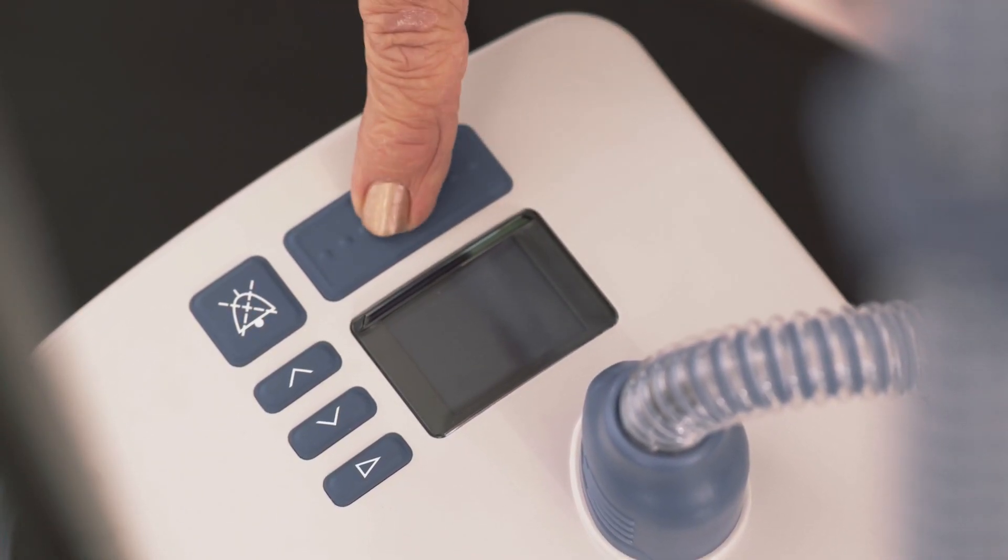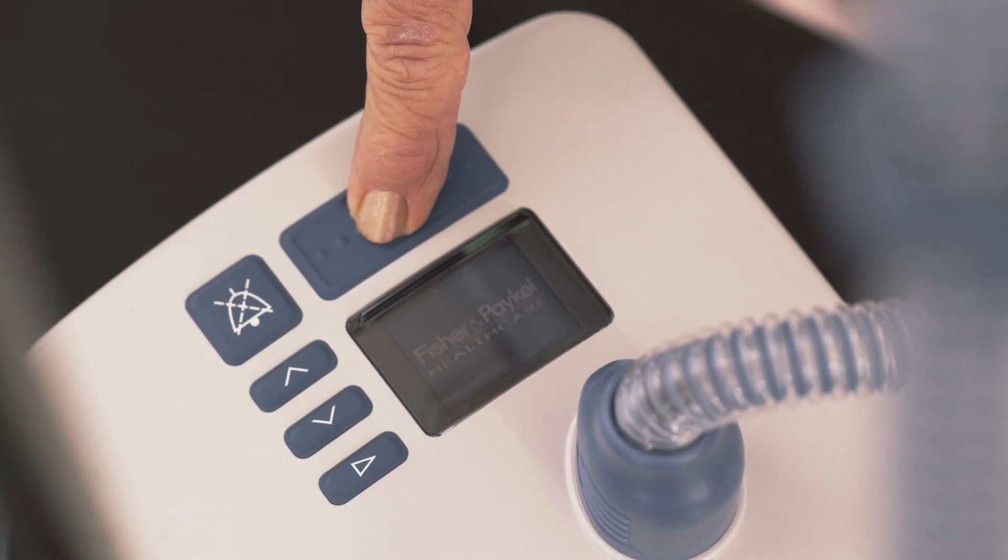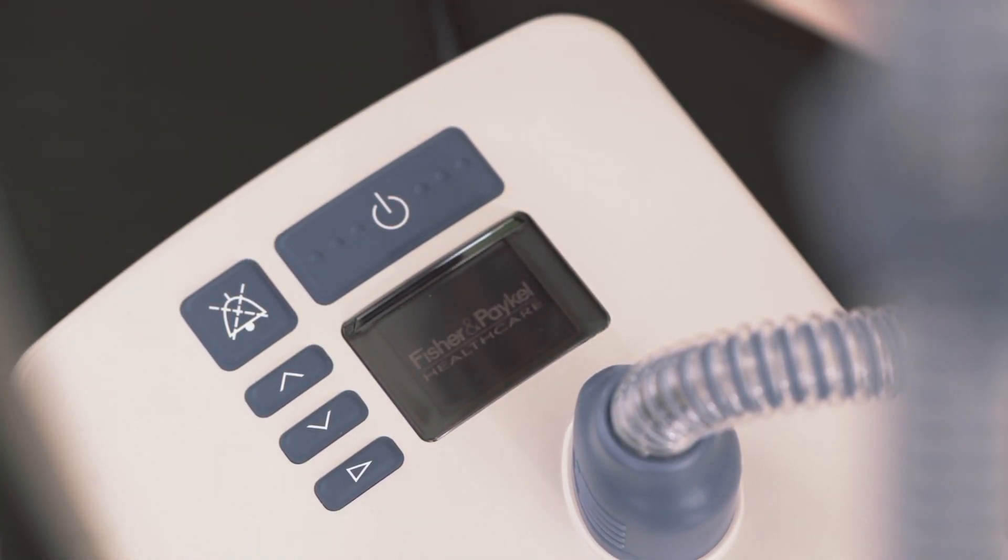Switch on the MyEVO2 by pressing the on-off button for 5 seconds. The unit will begin to warm up.